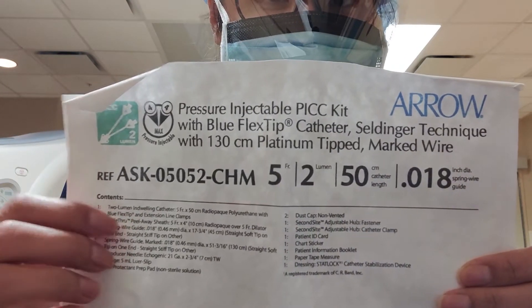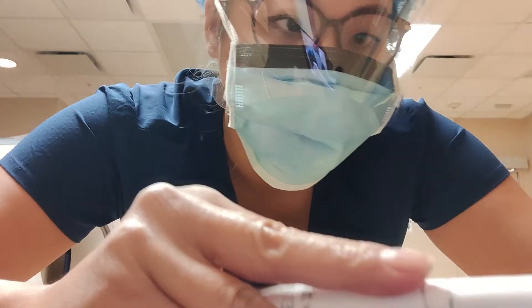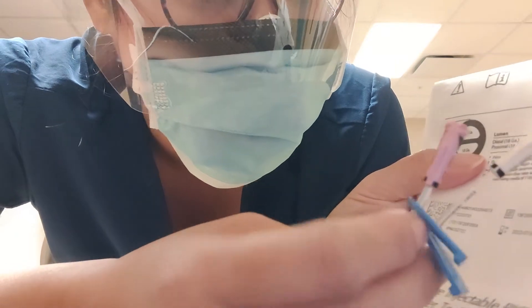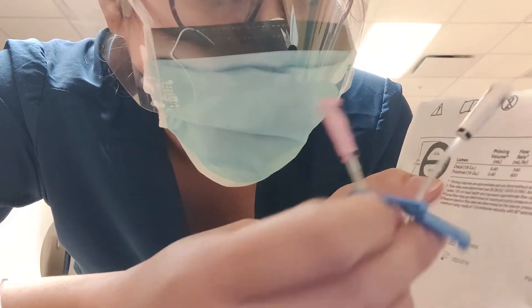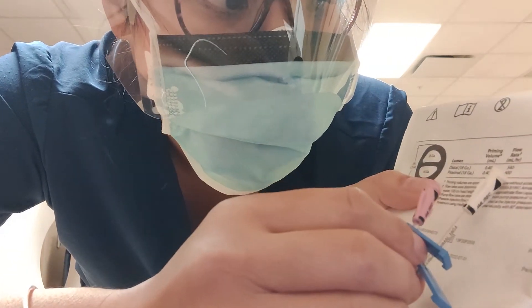This is the Aero brand PICC line, and it has all the information. I was told to look at the pressure rating here. Both the distal (the pink one) and the proximal are 18 gauge, and they both have a flow rate of 4 milliliters per second. But if you use it on a pump, the proximal can actually take a higher flow rate — 600 compared to 540 milliliters per hour.